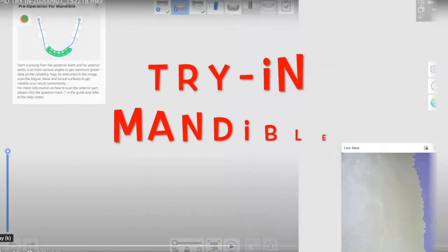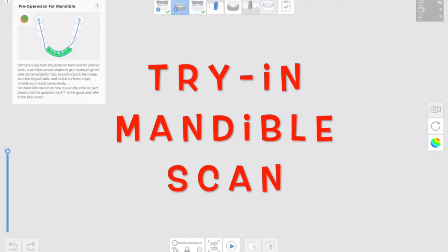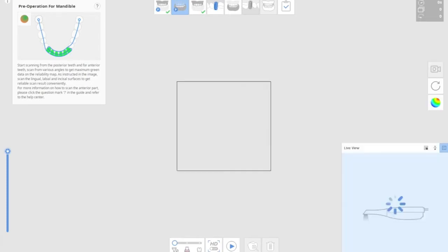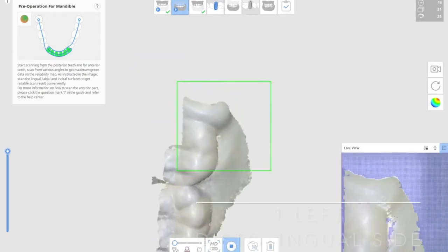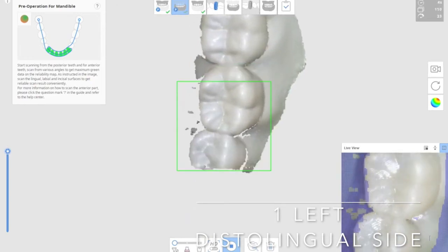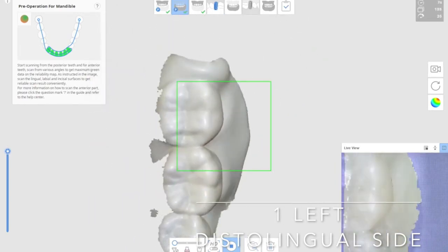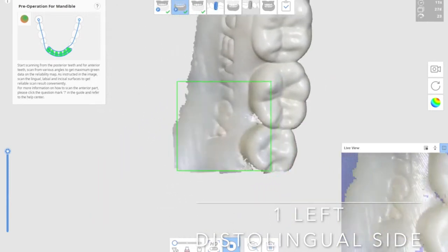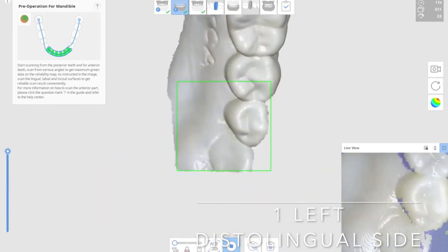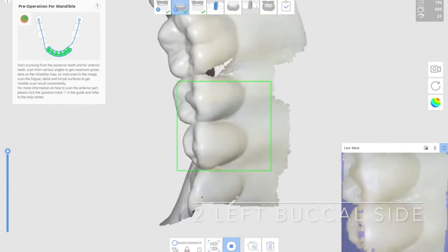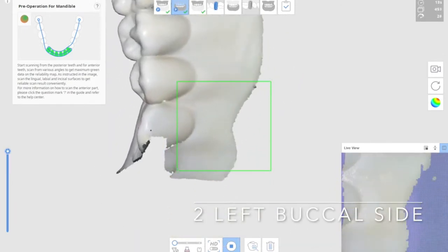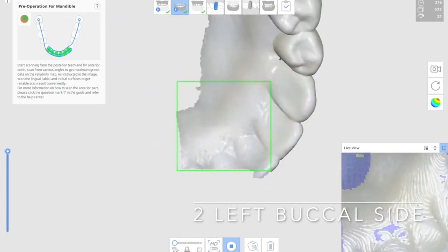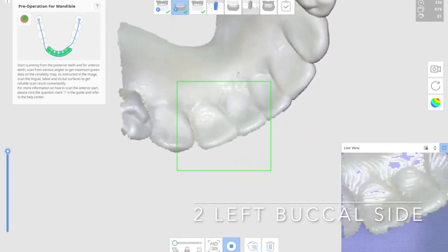Try-in mandibular denture scanning. So for lower, we start from the distal lingual side. But this time, distal lingual side, make sure you cover the teeth also. So while you are scanning the lingual side, make sure you cover the occlusal surface of the teeth.